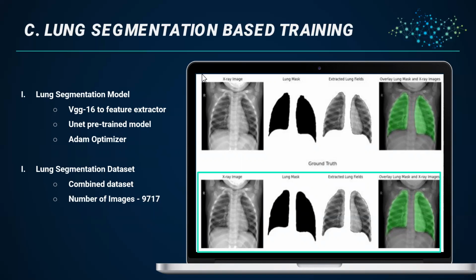We used the lung segmentation model to have a lung mask of the feed-forwarded chest X-ray images. Then we combined these masks with the corresponding X-ray images. Thus, non-lung areas are colored black. Then we follow the same procedure as in the previous experiments.